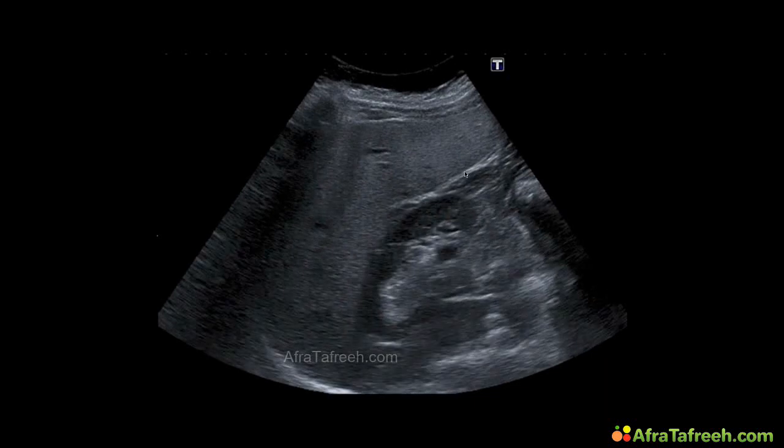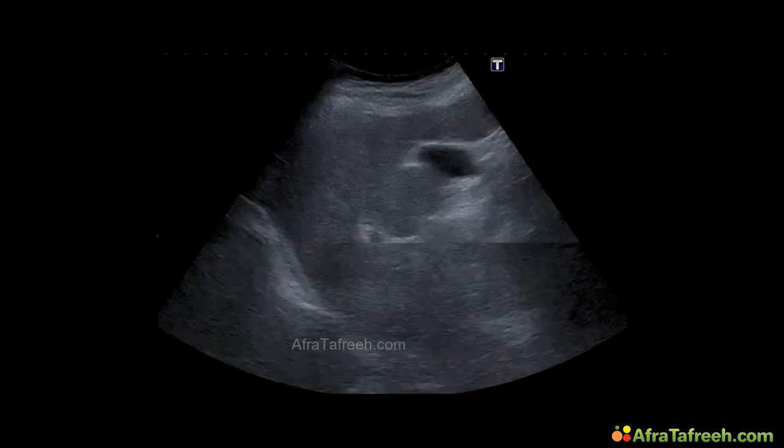We can see the liver is quite enlarged because it reaches caudal of the lower pole of the kidney. You see the kidney here in the longitudinal plane. And the liver has to be enlarged because it's a lot more caudal here than the lower pole of the right kidney. One more time.